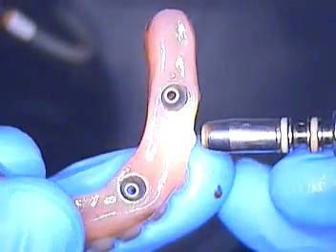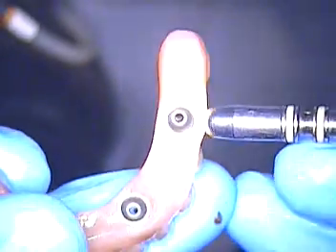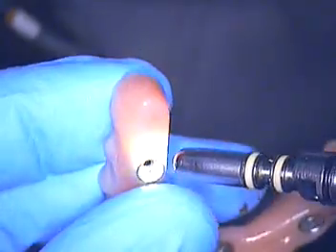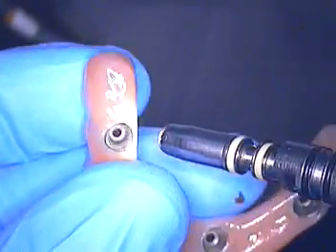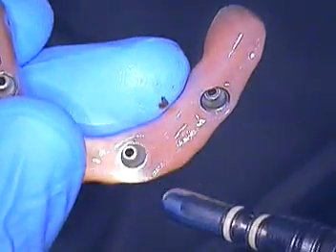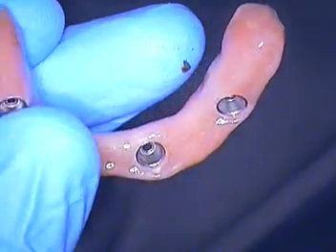And again, as I discussed earlier, there's no metal inside. There's a zirconia frame, but you won't ever notice that. The only metal are the little hubs, and they're actually cemented to the zirconia framework and then embedded in, wrapped around in the acrylic.